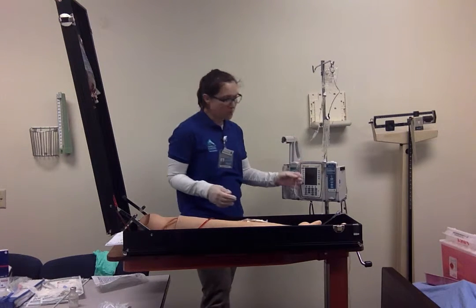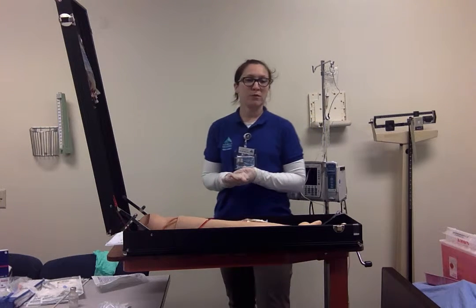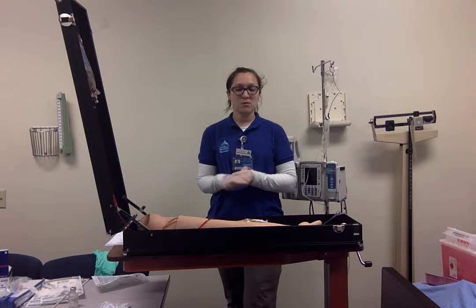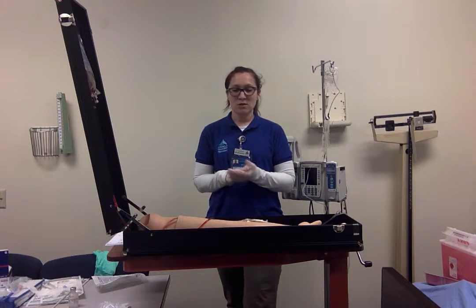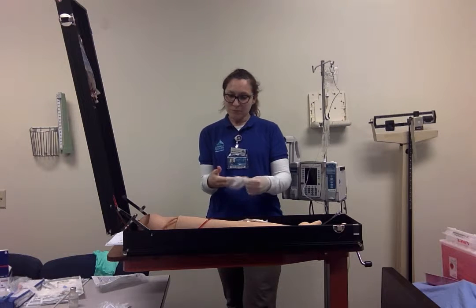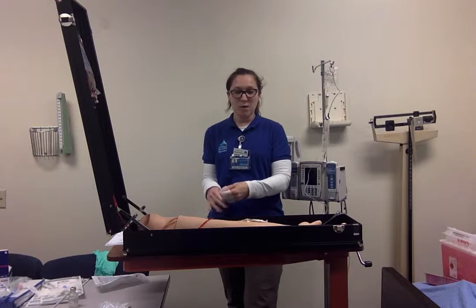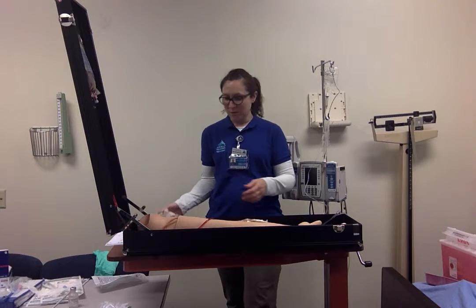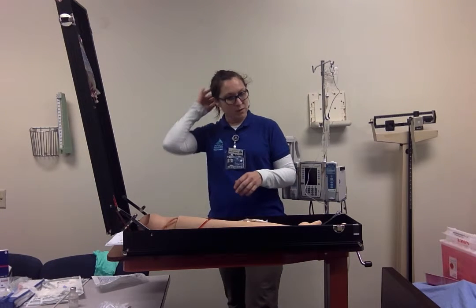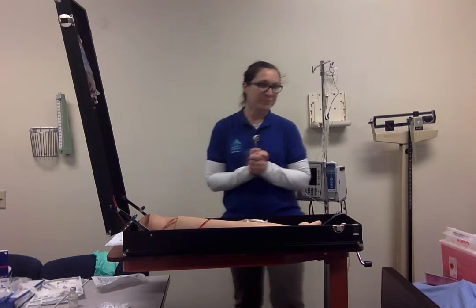All right, once that's running, I'm just going to make sure that the patient is comfortable. I'm going to check the 4 Ps: pain, position, make sure the bed is down, make sure he doesn't need to potty, and making sure he has all of his possessions nearby. I'm going to let this infuse probably for about 30 to 45 minutes, and I will come back in and see that it's done.